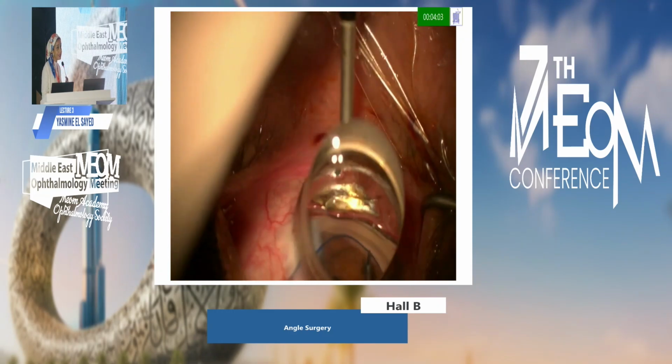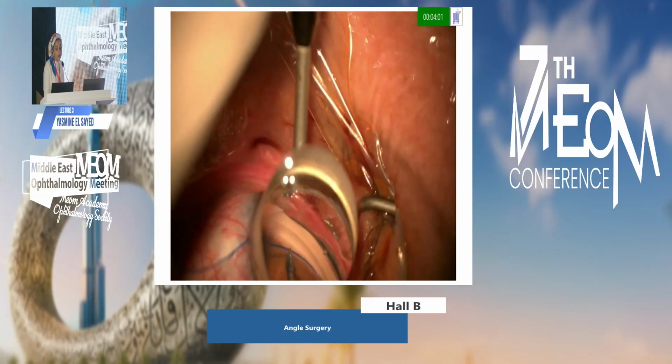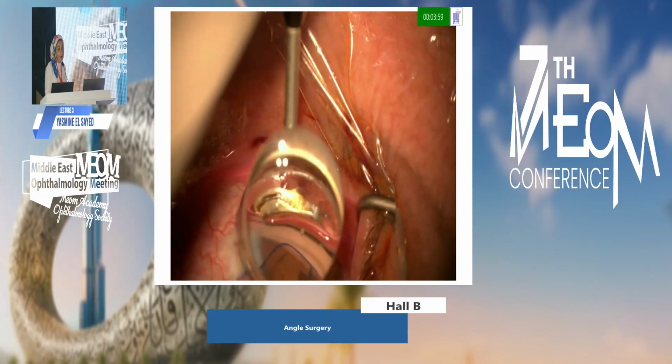Now, suprachoroidal passages are one of the nastiest complications. They can pass unnoticed.